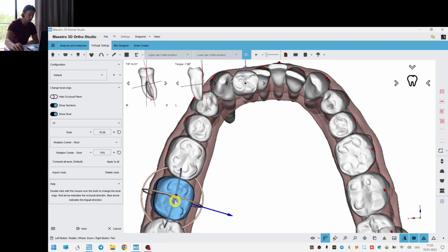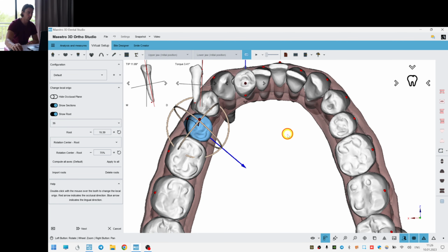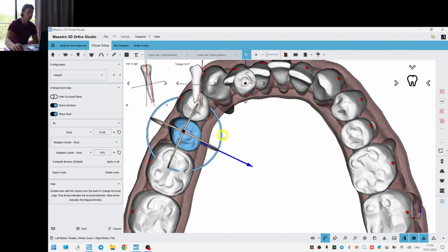Since I'm going to just expand the posterior teeth without rotations or some mesial distal movements, I position the axis this way so that the teeth just expand, nothing else. When we use this tipping movement, they don't go mesially or distally, just buccally. So here we can adjust it a little bit, position it more in the center of the crown.